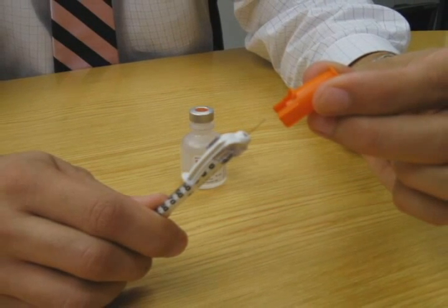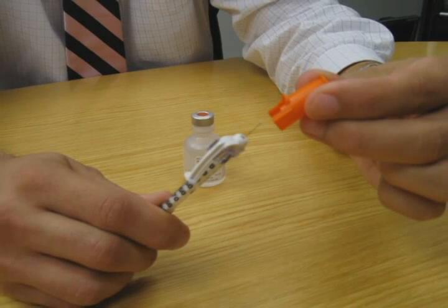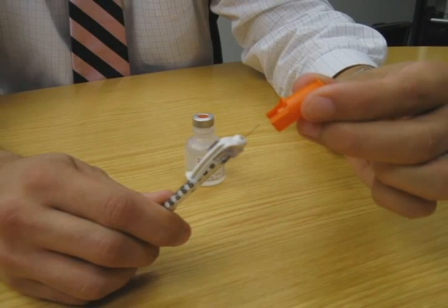Safely remove the cover of the needle on the syringe. Take care not to let the needle touch any surface other than the vial of insulin or your skin where you will inject the insulin.